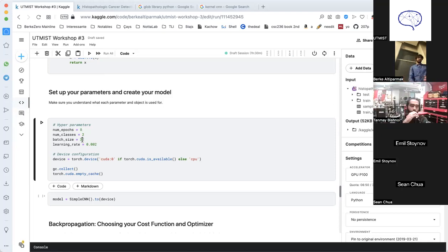So if your batch size is 32, after training on 32 images, not the whole training set, it will update its parameters. It will learn from these first 32 images. So batch size is a very important idea to start training early on. It doesn't wait to study the whole set of images to train itself. It studies 32 images and then trains itself.